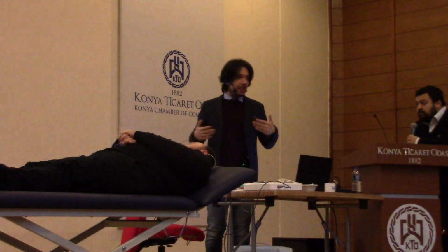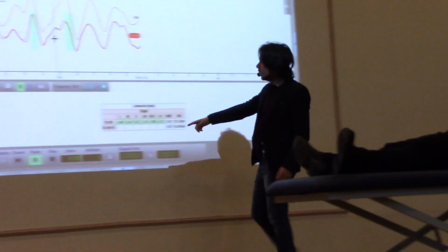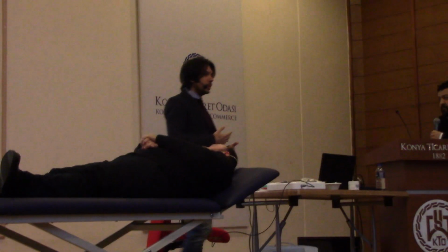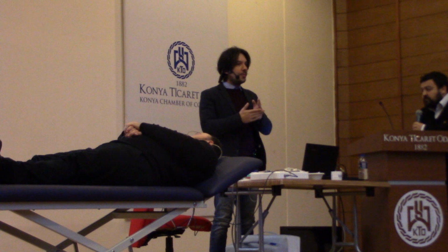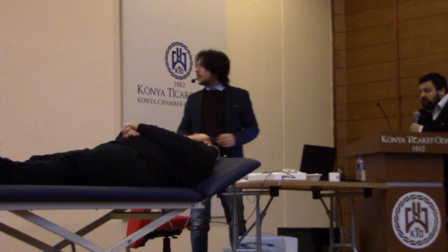But I repeat, what are sums? Here you see a counter saying sums, okay? They are averaging all the acquisitions, averaging all the responses to each click it is sending. If you hear in the headphones, you hear ta ta ta ta ta ta.